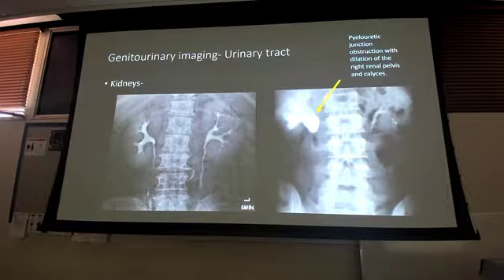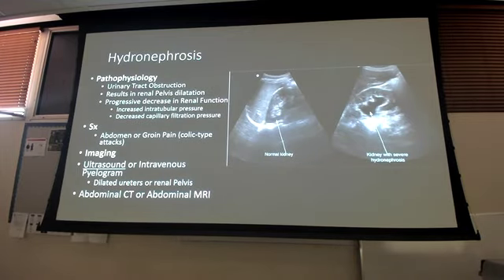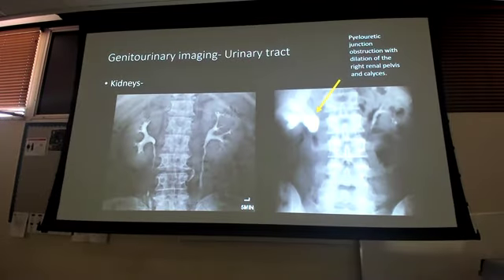This is where these IVPs can really come into play. So if you get somebody who's having the pain, you're like, yeah, no, you're not having hydronephrosis yet, you're out in the field. All right, here's some meds, it's gonna suck, but we can kind of push through this. You get this, they probably need to leave, because that's not gonna fix itself on its own. They need to at least get somewhere that can take care of this and break that stone up. And that's where this IVP comes into play. And because this gets into when do we order an ultrasound, this is where we'll stop.